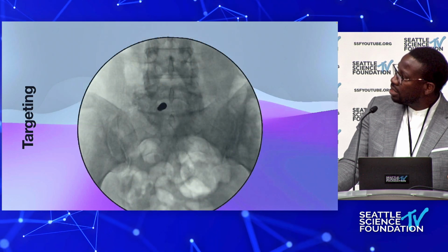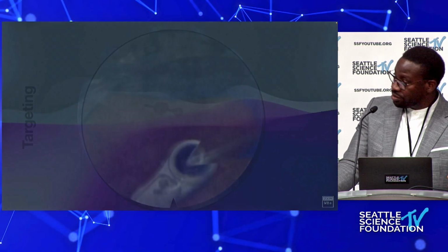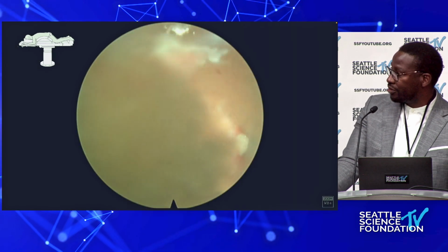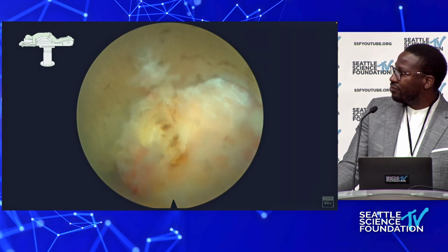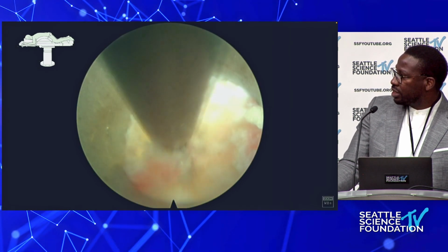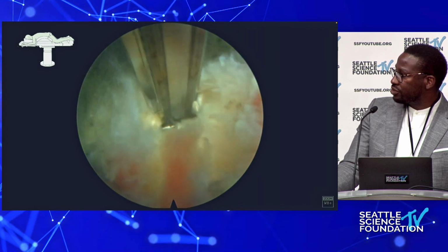And this is actually the case of that patient that had the cauda equina syndrome. And I promised I would show you the interlaminar video from the surgery, and this is, of course, abbreviated. We land on the ligamentum flavum. We make an opening in the ligamentum flavum. Then we use Kerrisons to widen that ligamentum flavum just so that we can get in our instruments.